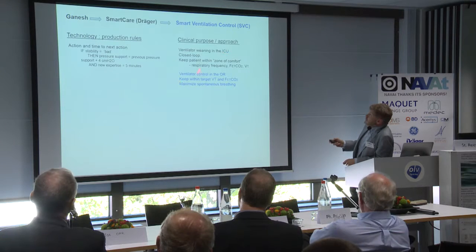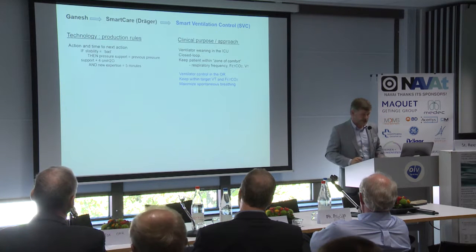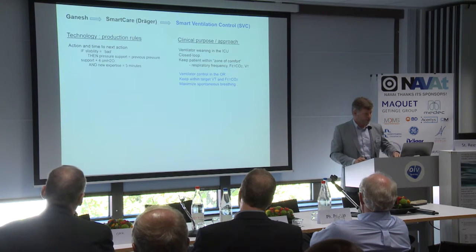So great breakthrough there. My emphasis here is to talk about the technology. What they have, I have noticed recently, is that they've now brought this system out into the operating room, which they call Smart Ventilation Control. I personally haven't seen any studies related to that as yet. You might know more than me.